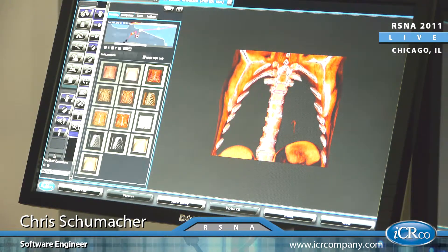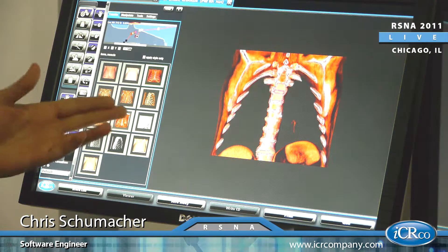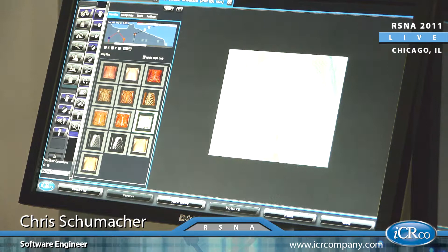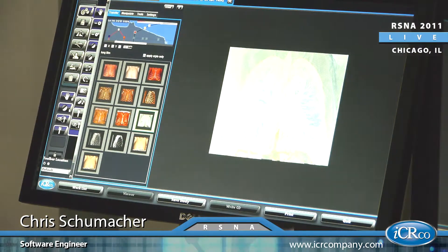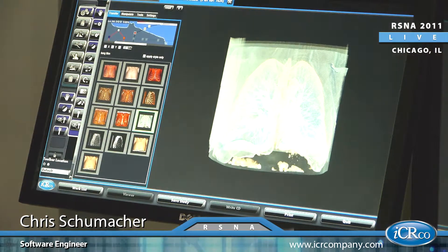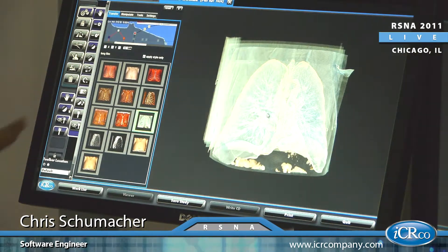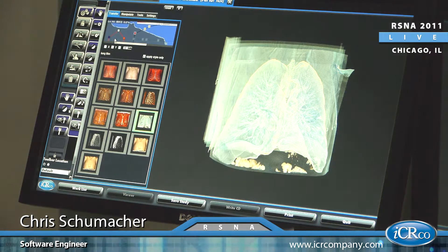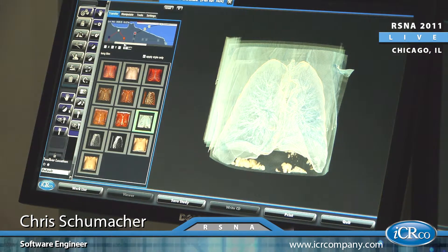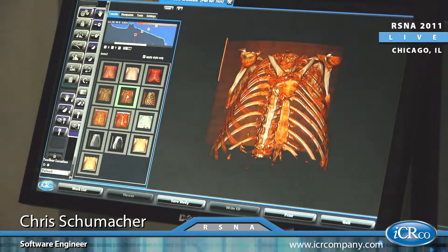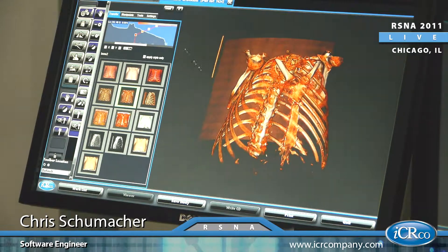Once again we can change the transfer function. This will accentuate the lungs. And this is all the same data — we're just using a different transfer function. And back to bone.